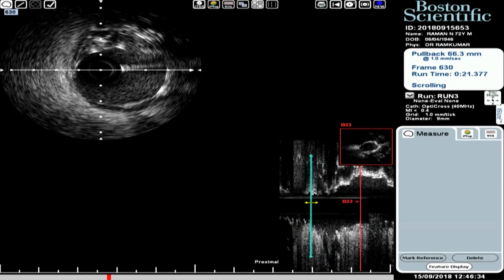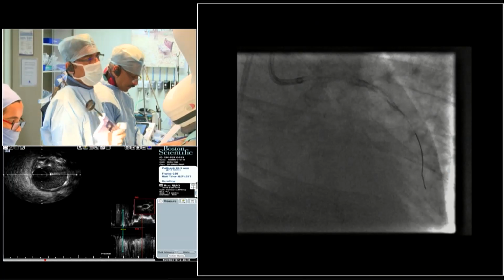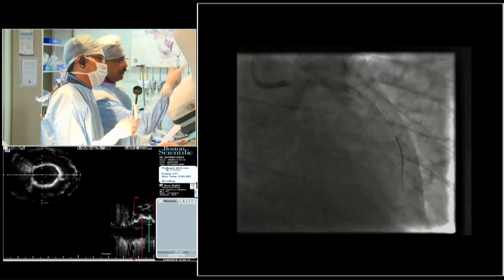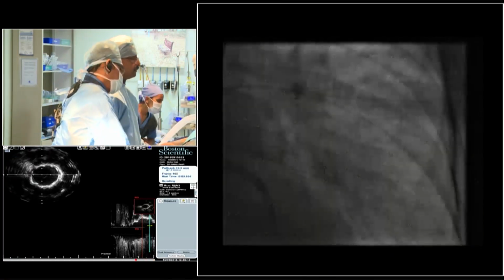So what do you think? I think you should have a 4 millimeter balloon. 2.5 coming. 4 millimeter balloon. Okay, so we'll use the same 4, no problem. Yeah, we used it already. The position was not very appropriate. So here's the first balloon going in, 2.5. And then keep the 3.0 balloon ready, sister. 3.0 balloon and 4 millimeter balloon again, sister. And go to the diagonal picture, cranial, where the diagonal is. So we're going to start our dilatation just above the diagonal.